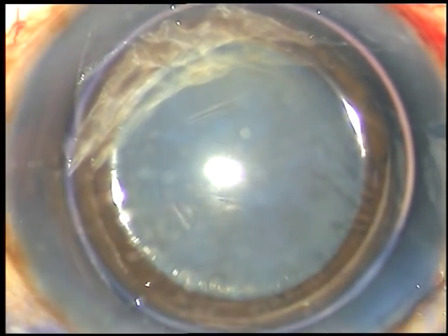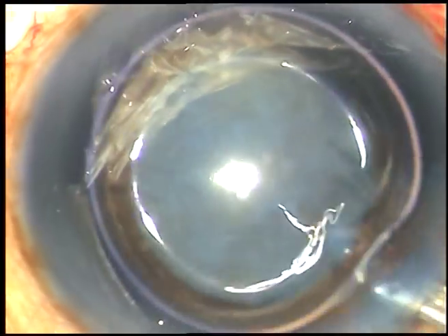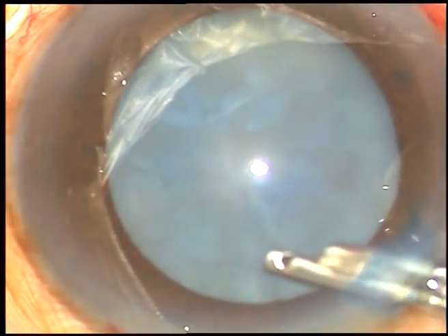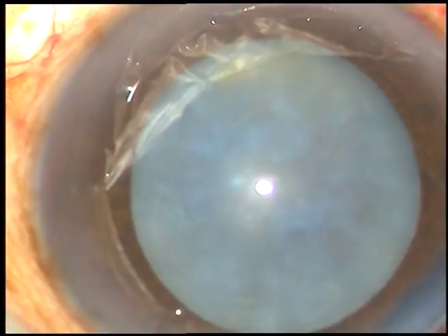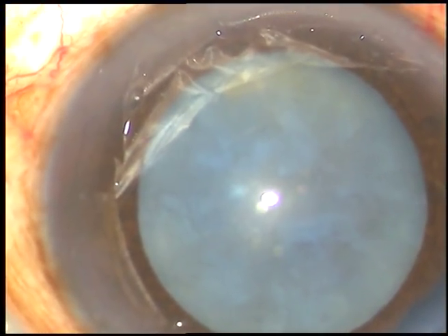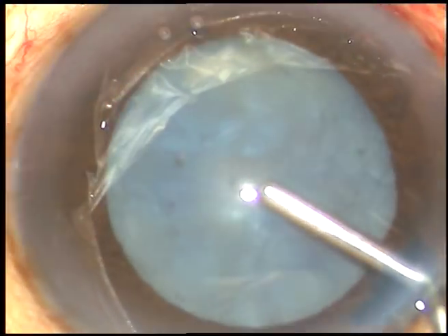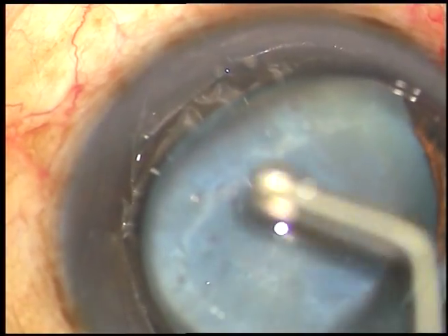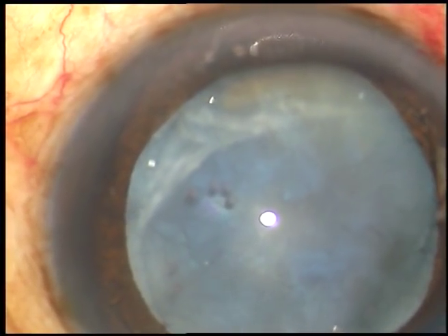This is a bit of epinephrine. It may help in keeping the pupil dilated. The viscoelastic substance being used in this case is 2% hydroxypropylmethylcellulose, and no other viscoelastic substance. The HPMC is spread over the corneal epithelium for better visibility.